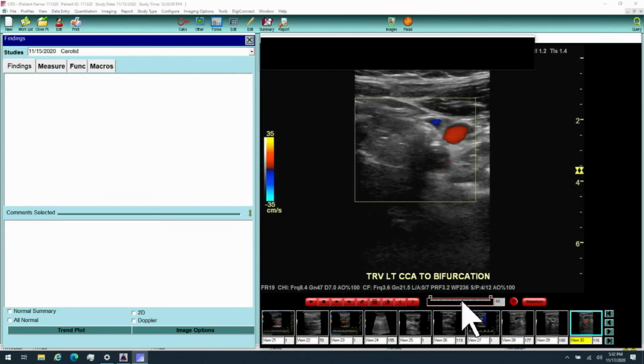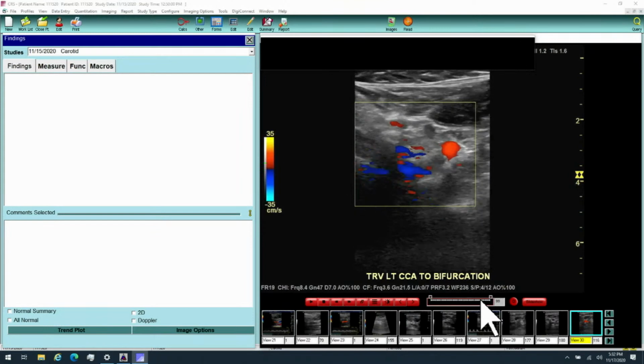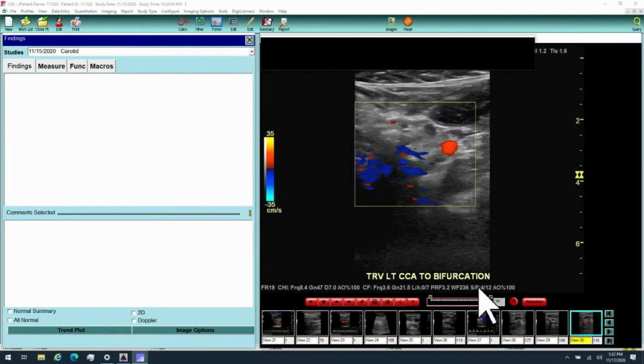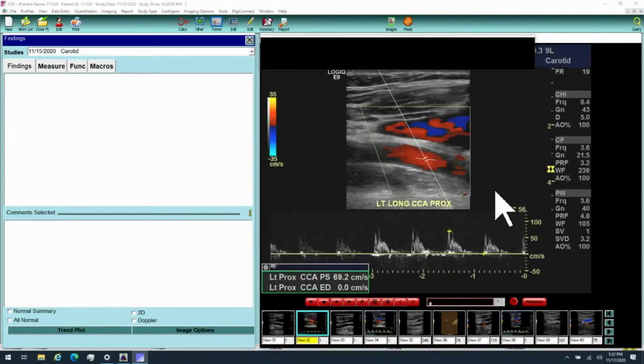So here's the distal CCA moving up, up. There should be the bifurcation here. Yeah. And that's not the thyroid cyst. So this is where you see that dark hole and a circle that definitely maybe. Right here. Probably the best frame here. So your ECA, I think I see it here. Okay. Yep. Smooth intimal lining.